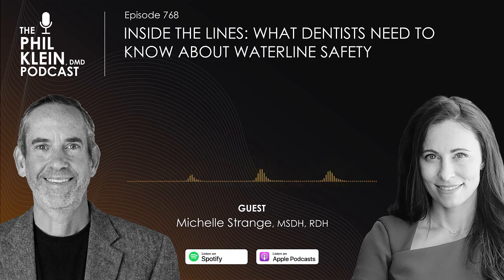So then you're going to say, okay, we're going to go with a cartridge straw system. Do we want to have compatible products, or are we okay with somebody knowing that there might be an extra step of taking that straw cartridge off and then putting the dummy straw on to bring up that shocked water?